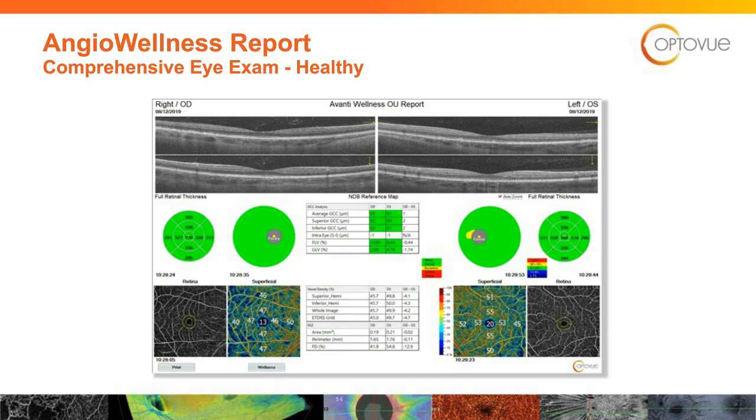I'll click on the wellness button. The beautiful part of this is there's one button that you hit, it populates and pops up this image right here, all in one report. I can't tell you how important that is. I usually start in the middle. I'll go through my spiel here. As this is opening up, hopefully these numbers that pop up in the ganglion cell complex, if there's another scan along with your pressures for glaucoma, hopefully they're between 85 and 100. And I would say, well, voila, they are.